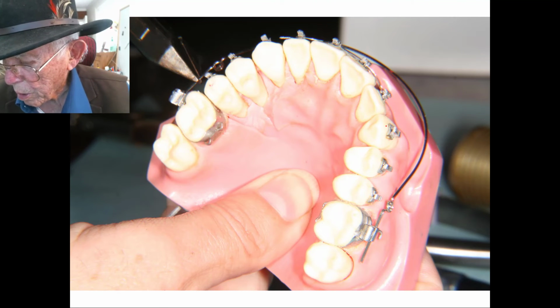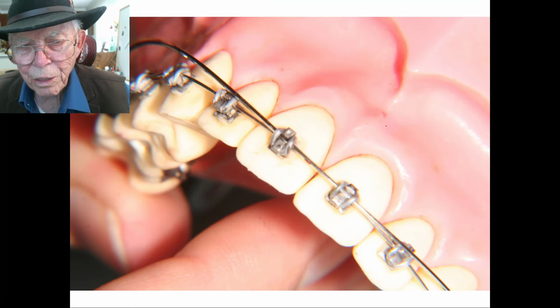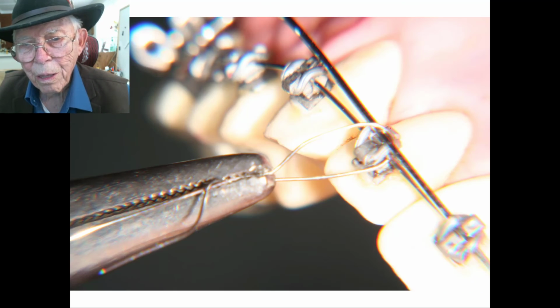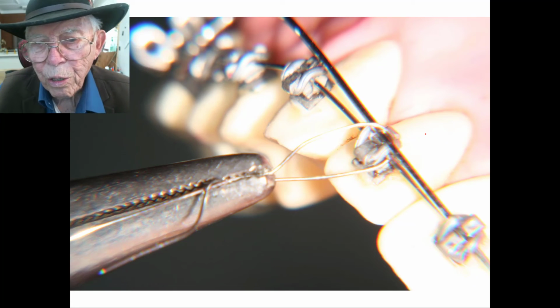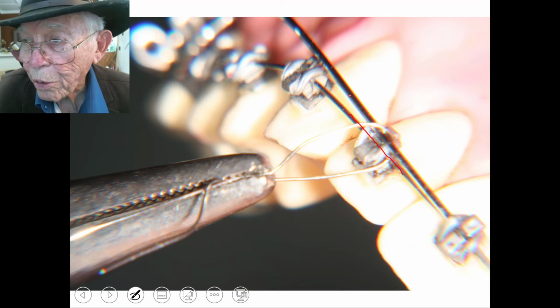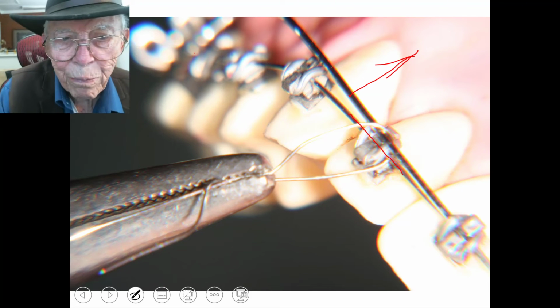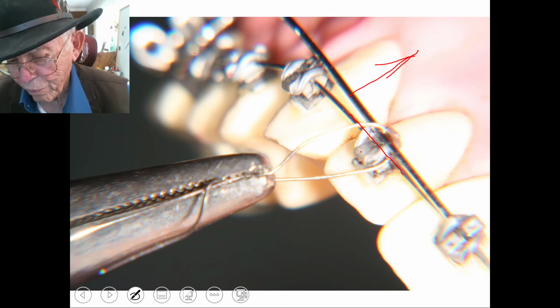All right, let's go here now for the next deal, and we'll pull that down. We're going to tie that together again. Now we're going to tie this wire here to the other wire in the typodont, and this is the intruding wire. It will pick these teeth up like that, and the other one ties this back, so it won't let them flare out at all in that fashion.